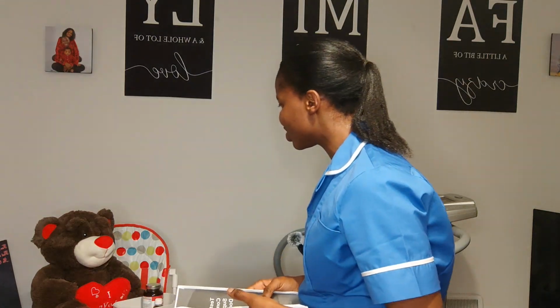All right, so I'd already worn my apron here. So I'm going to pick a pair of gloves now and keep it in my tray. Okay, then I'll perform my hand hygiene following the 7 steps of WHO standard as I go back to my patient. All right, Janet, I'm back. Are you still happy for us to continue, please?